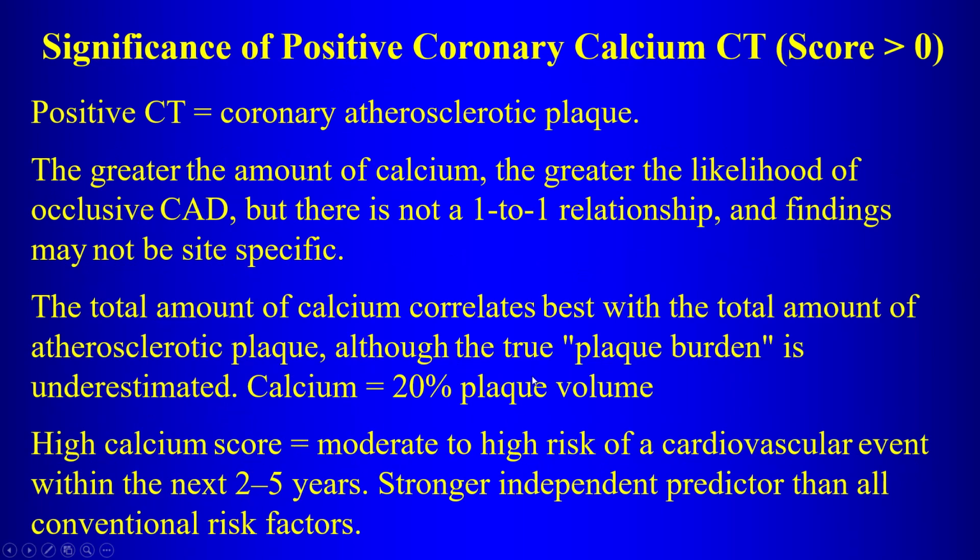Now, the significance of a positive coronary calcium CT, meaning any calcium score greater than 0. A positive CT means there is coronary atherosclerotic plaque. The greater the amount of calcium, the greater the likelihood of occlusive coronary artery disease, but there is not a one-to-one relationship. The calcium is a marker for disease.